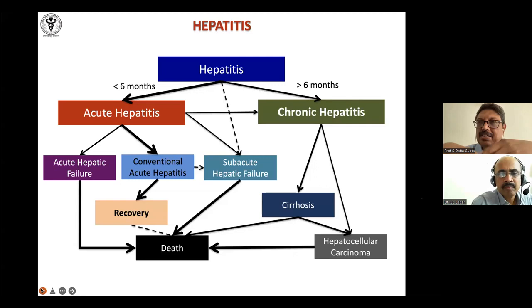But first, on the lower power, you see the entire architecture. Whether there are nodules, whether there is any inflammation, particularly in certain portal tracts, like in HCV, will be there. Then you take your focus to that side, and then you start from that end. See if there is any cholestasis. If it's repeating in all the centrizonal areas, then you know there's some problem in the distal bile ducts. You're seeing cholestasis everywhere, and so on. So that's how it's done.